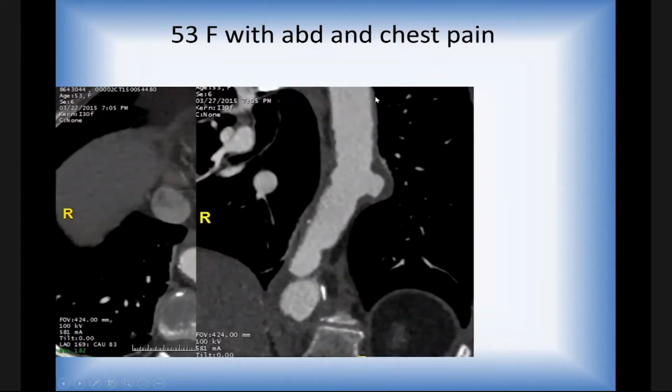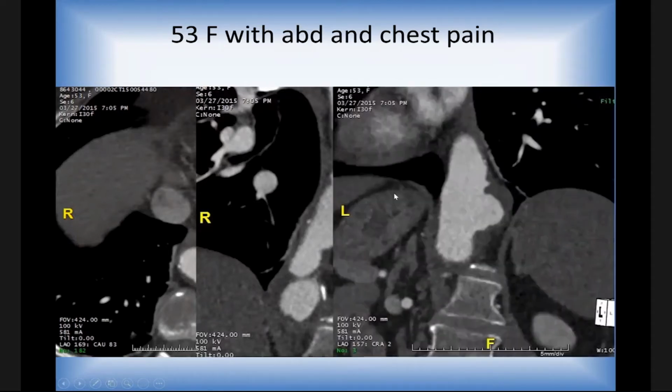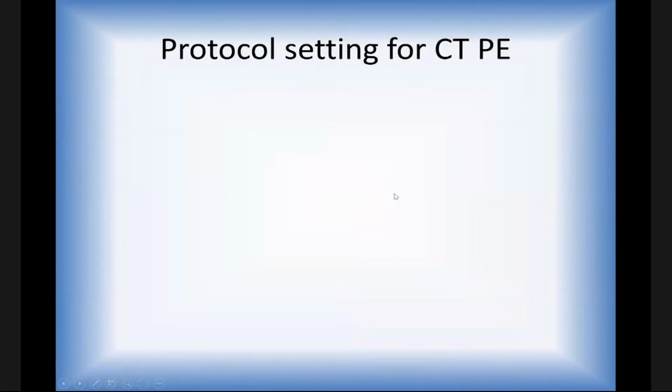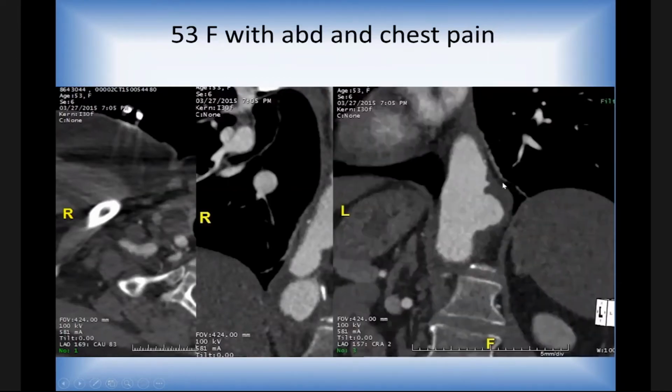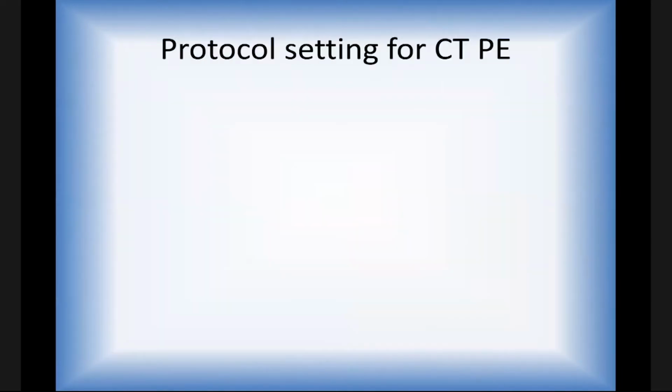Normally, with intramural hematoma, you're not going to see it in only one location. You see it all contiguous from here to here. But this is just a very focal bulging here. This is the magnified view of the same lesion. So this is a penetrating aortic ulcer, Type B.